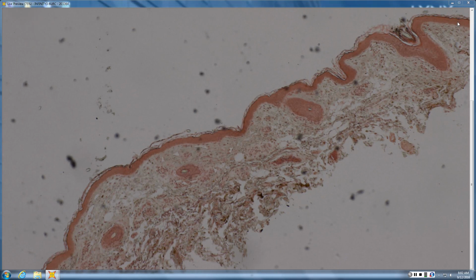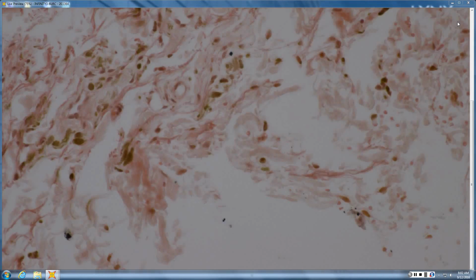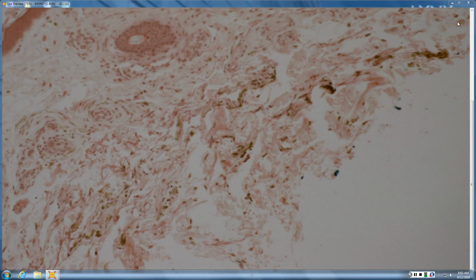Okay, so I see some cells scattered in the dermis. Let's get a closer look at them. It could be some of those dendritic melanocytes. They're dendritic, and what directions are they going? Kind of east-west. Any thoughts? So maybe like a nevus. Is this on the face or the leg? That would be a good question. If this is on the face, it's Ota. If it's on the shoulder, it's Ito. If it's bilateral on the face, it's Hori. It's one of those benign dermal melanocyte things.